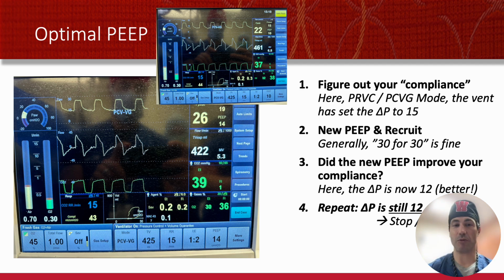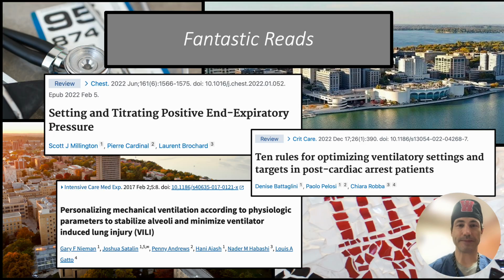You may want them to be on the low end of your optimal PEEP and avoiding any sort of pressure injury. So that's how you decide between 10 and 14. In this case, you might split the difference and go to 12.